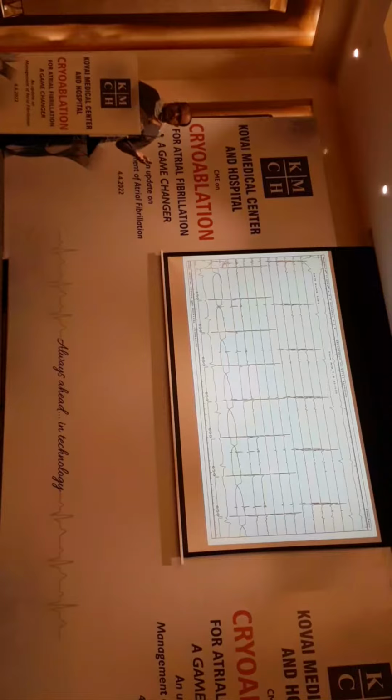This is a step which is going to determine how long the patient is going to remain in sinus rhythm. As long as we are able to isolate the veins completely, one great advantage of pulmonary vein isolation with cryoballoon is that the consistency and the level of isolation remains over a period of time. There is enough data which shows that if you are able to achieve these kinds of isolations during a procedure, this isolation is going to stay.